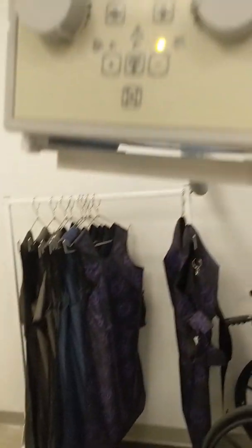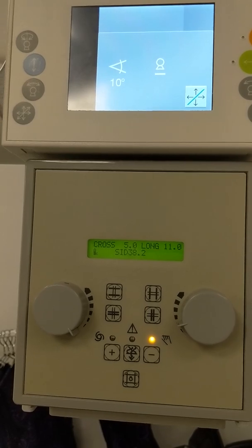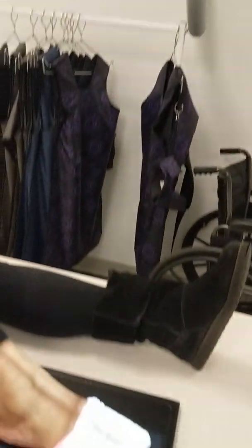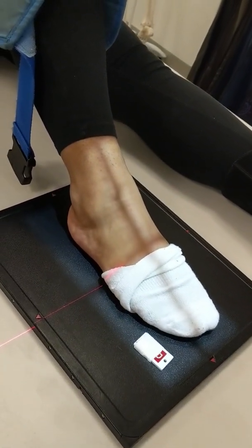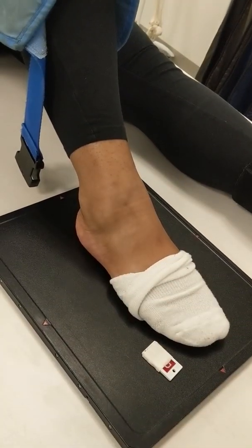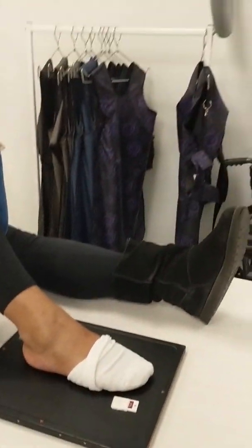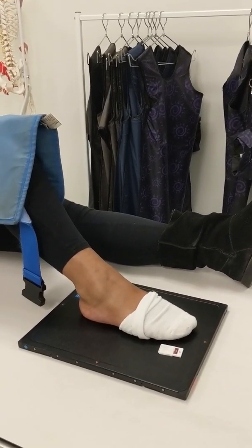We started with a 40-inch SID, and then we adjusted down to 38 because we added a 10-degree posterior angle. We made sure that our marker again was on the lateral side up near the toes so that it's appropriate when you display. Our patient is shielded, and her breathing instructions are to hold still and expose.